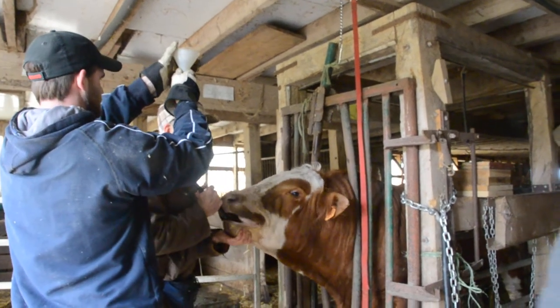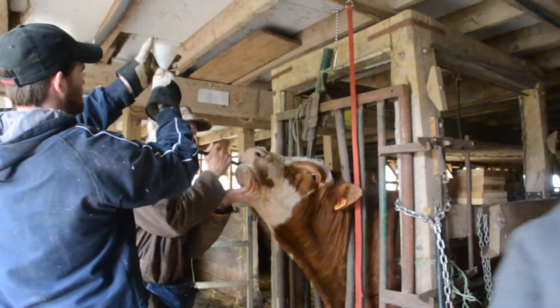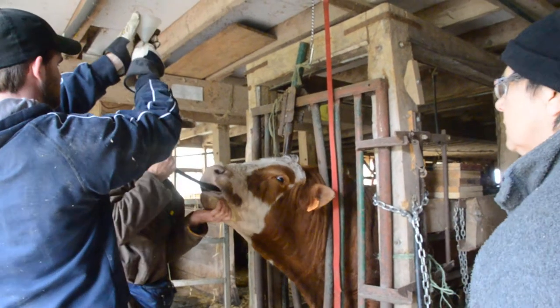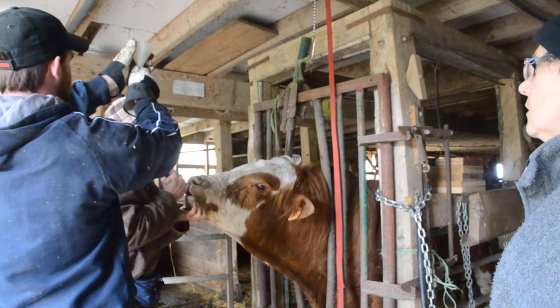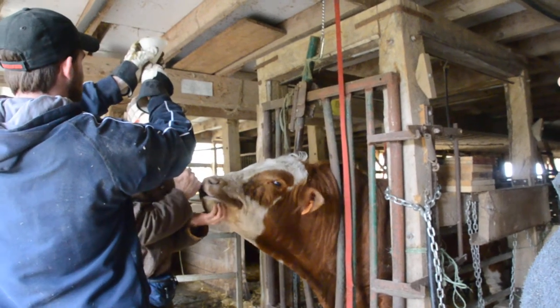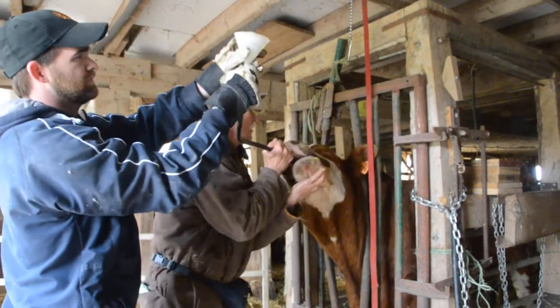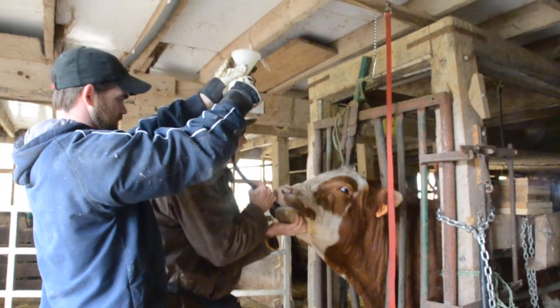I think we might as well use it up — and it's gone down. You can pull the tube out a little. I just want it to be drained when you pull it out, so that liquid doesn't run out as you're pulling it back out.